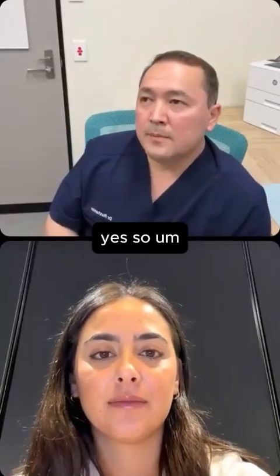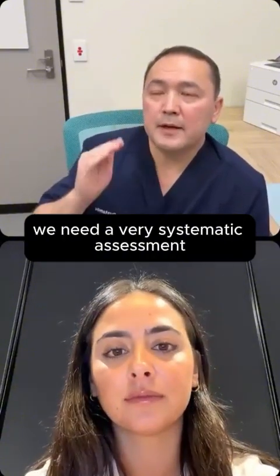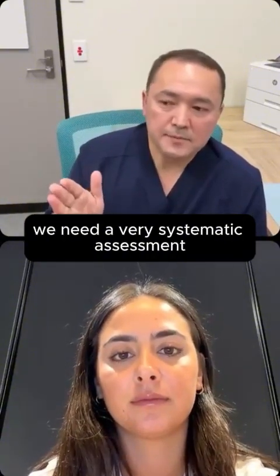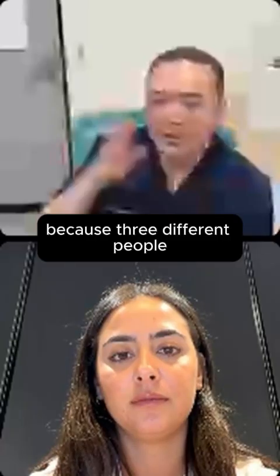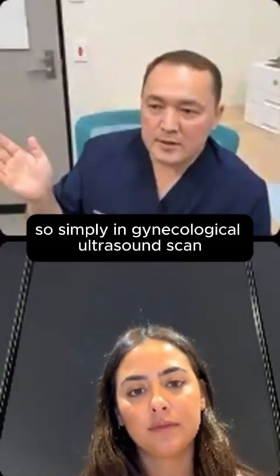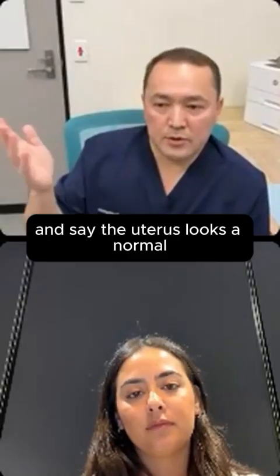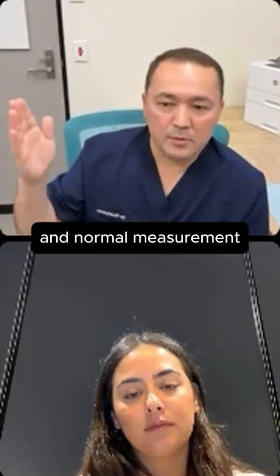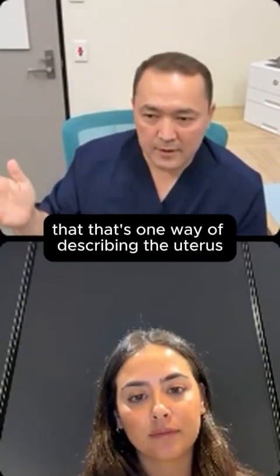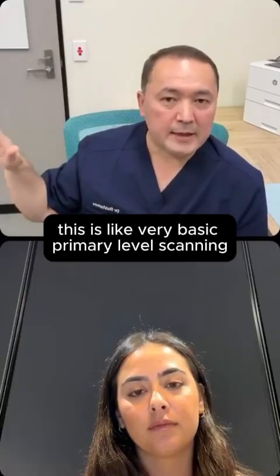Yes. To diagnose a uterine pathology, we need a very systematic assessment, because three different people who scan the uterus can describe it three different ways. In a gynecological ultrasound scan, they can simply give you uterine measurements and say the uterus looks normal, with normal measurements. That's one way of describing the uterus. This is very basic primary level scanning.